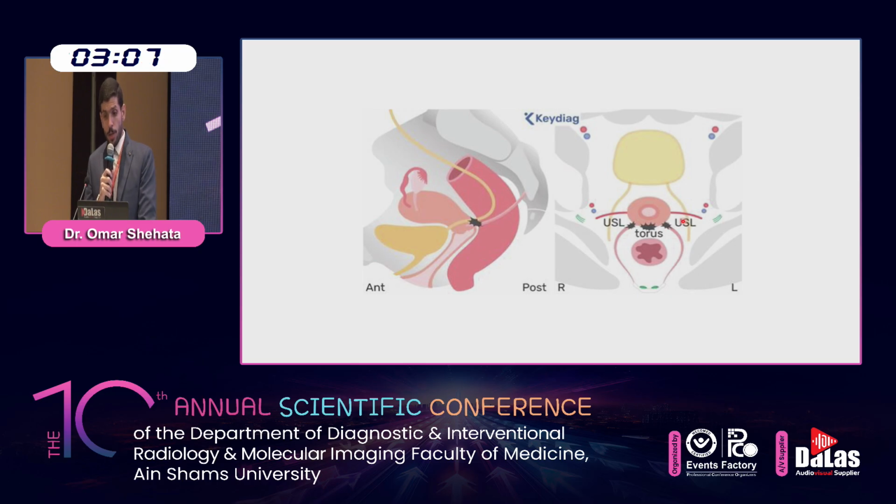By MRI, uterosacral ligament thickness is normal if it's less than or equal to 3 mm. If any increase in thickness or nodule is visible, or if a T1 bright spot is detected, abnormality is usually considered. Information needed by surgeons in MRI is description of the site, whether proximal or distal. The infiltration of the mesorectum is also an important element to report, especially if the infiltration extends laterally, as this makes the surgery more complex.